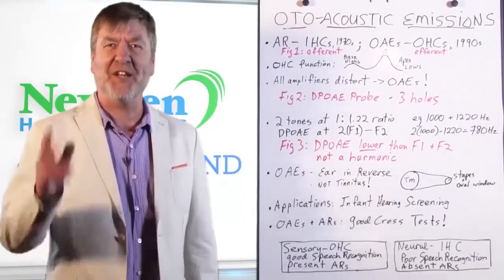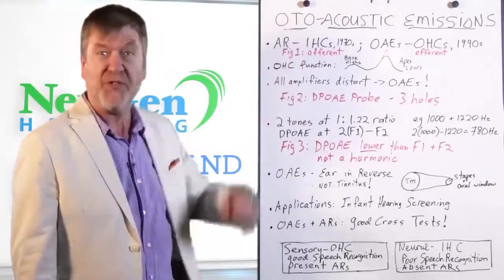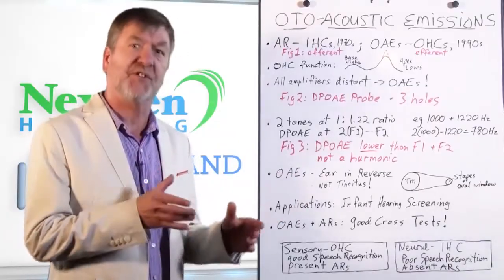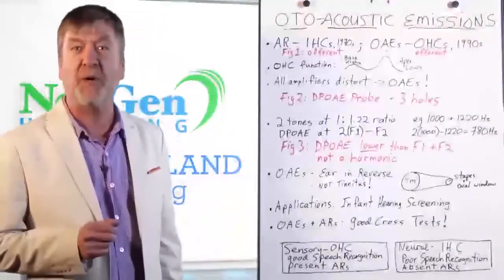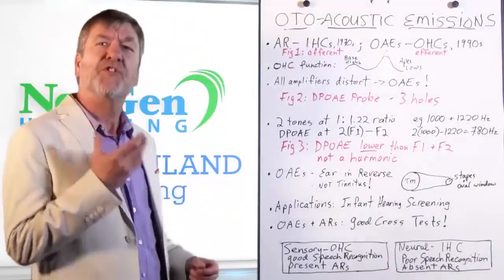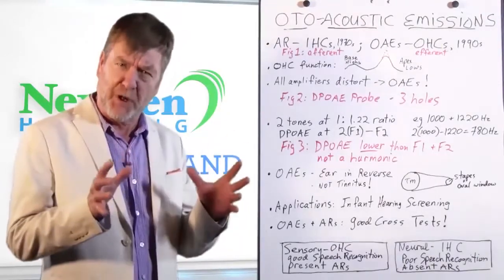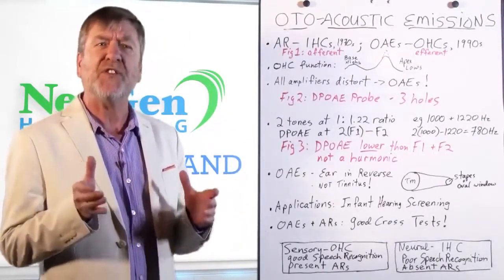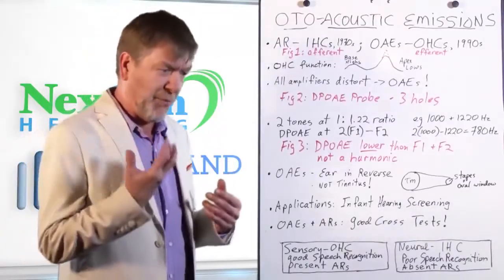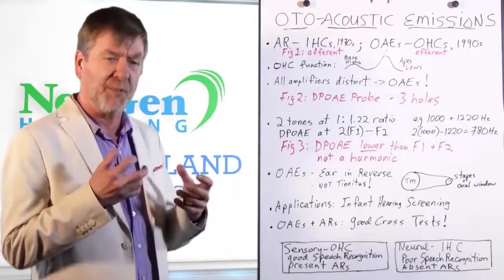Hi, I'm Ted Venama, here to talk to you today about otoacoustic emissions. This can be construed as a counterpart to the test of acoustic reflexes that we spoke about last time. You'll recall last time when we talked about acoustic reflexes, we said that was a non-behavioral test, part of tympanometry, and it was used to test the function of the acoustic reflex, a non-behavioral type of phenomenon that occurs, the tightening of the little middle ear ossicles.